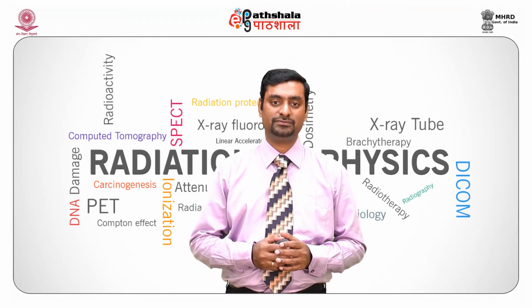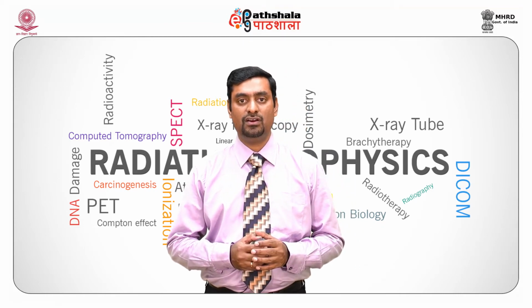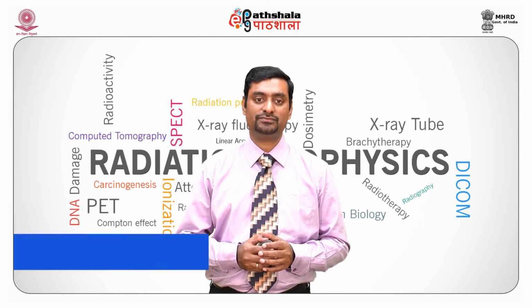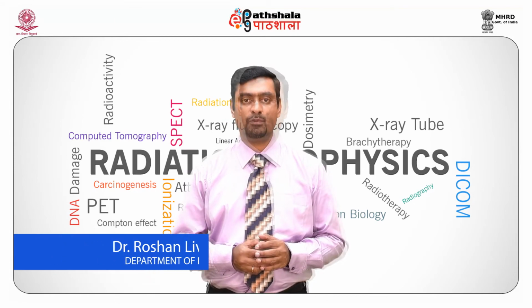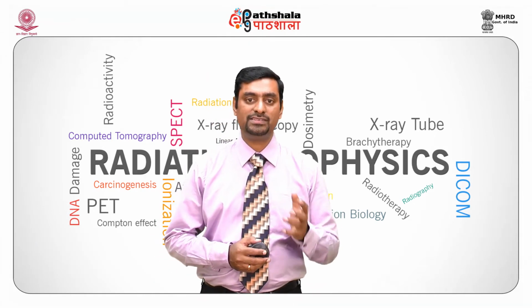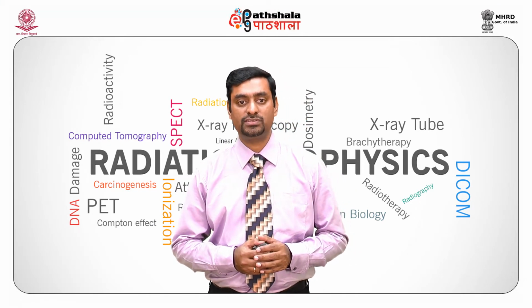Fluoroscopic equipment. Fluoroscopic equipment may have image intensifiers, or the recent ones have flat panel detectors for real-time imaging. It can be equipped with either an undercouch or an overcouch X-ray tube. Mobile C-arm. What do we see in a mobile C-arm? The mobile C-arm is used in operation theatre for orthopedic and urological surgeries.